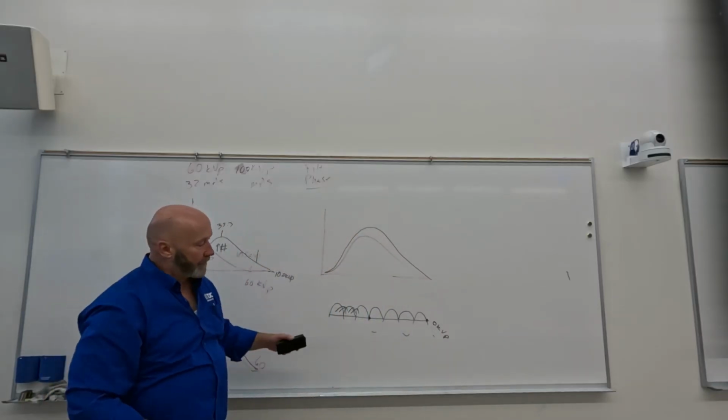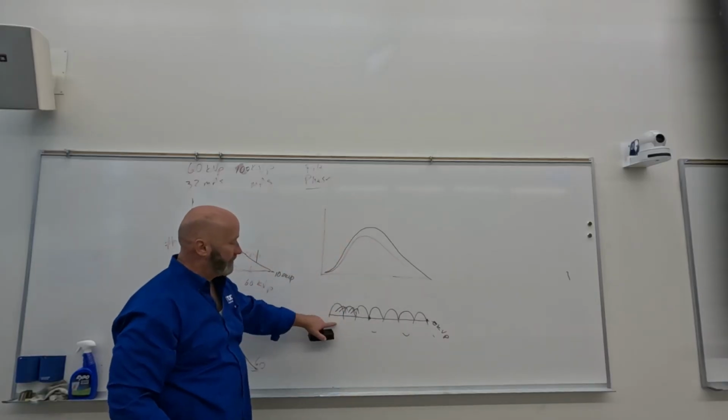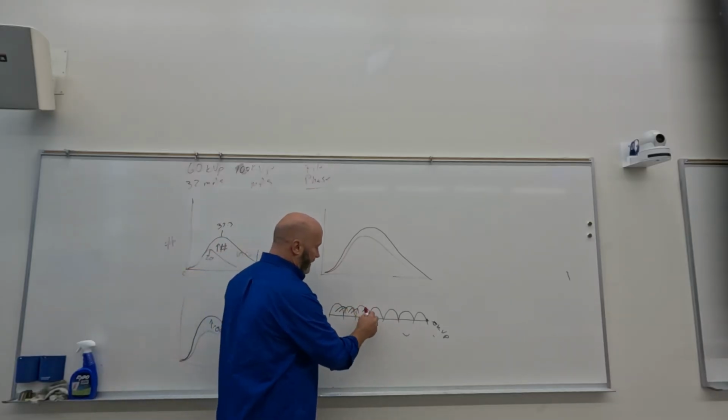All right, that's 0 kVp. So that doesn't look like 0 kVp. Does our overall waveform get to 0 once I go to 3 phase and I start filling in these gaps?